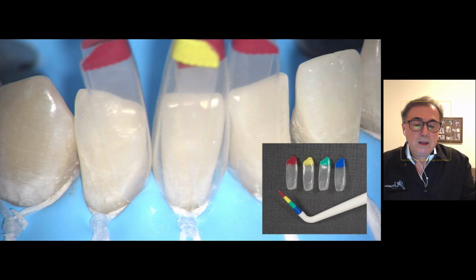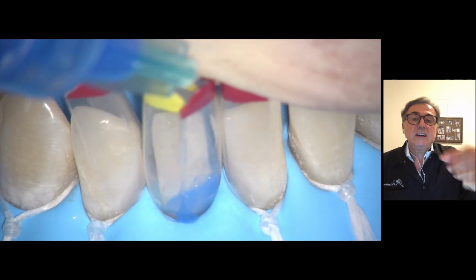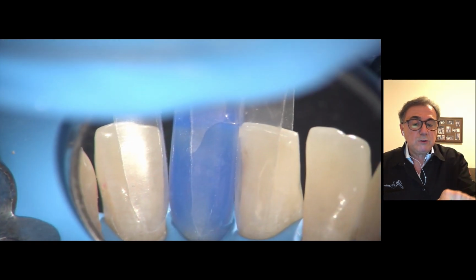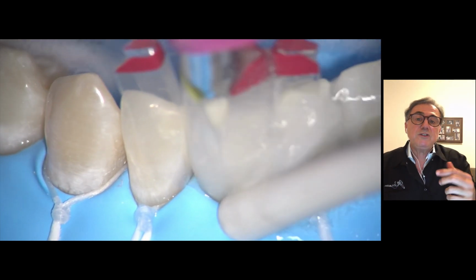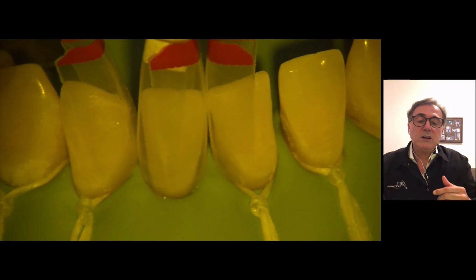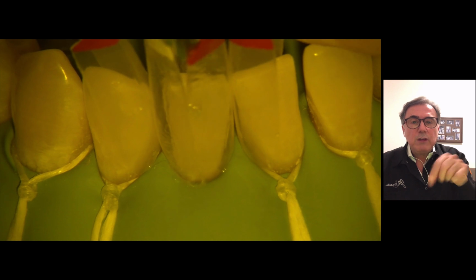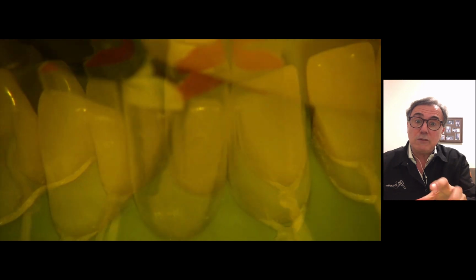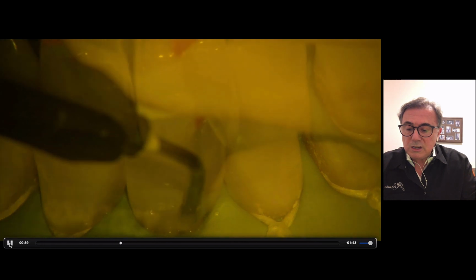All right. After we do that, we're going to do the acid etching, very carefully making sure we're doing that on the buccal surface and on the lingual surface. I have to check that with a mirror. That's what we're doing over there, okay? We're checking with a mirror to see that we have the tooth properly conditioned. After that, you wash it thoroughly with water, and then you place your adhesive. You place and scrub your adhesive through the whole tooth inside the matrix for at least 20 seconds. And then you evaporate the solvent thoroughly, very strongly, and I'm going to stop the video here just a little bit.